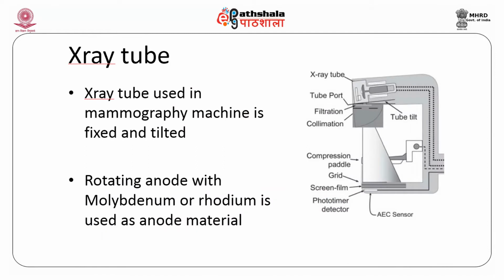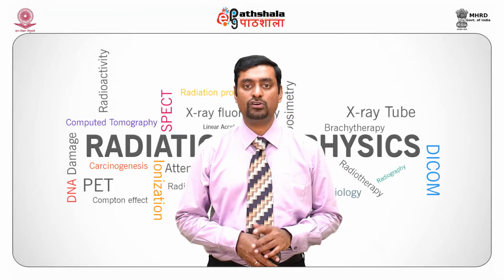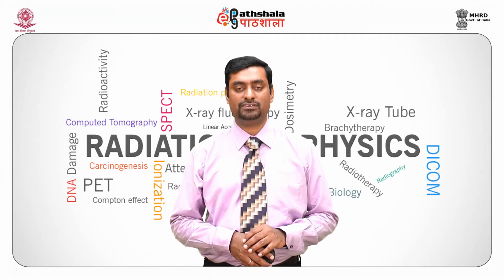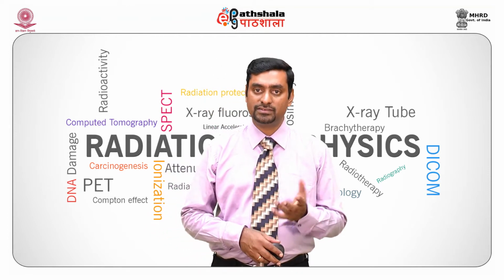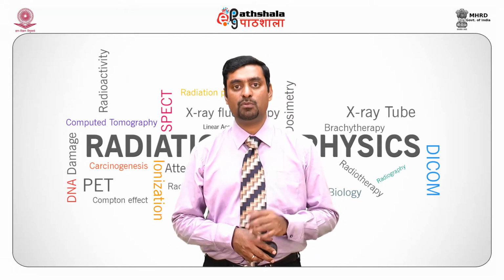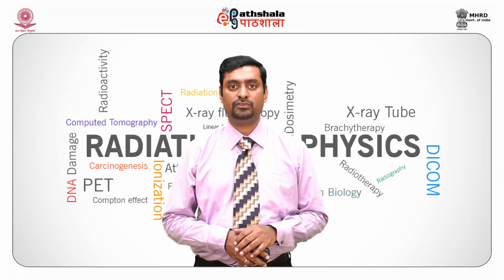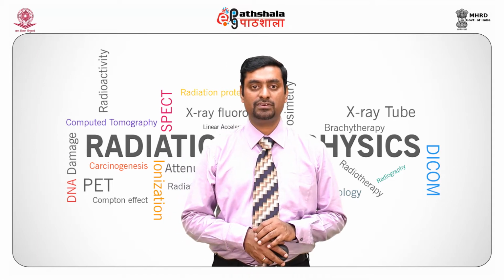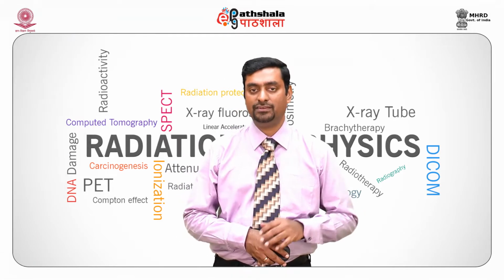X-ray tube. The X-ray tube of a mammography machine is fixed, but as seen, it is actually tilted. It has a rotating anode X-ray tube with molybdenum or rhodium as the target material. Generally, in a conventional fluoroscopy machine, it has tungsten, but in a mammography machine, it has molybdenum or rhodium. Currently, for tomosynthesis procedures, some of the companies manufacture tungsten targets because of high heat loading.